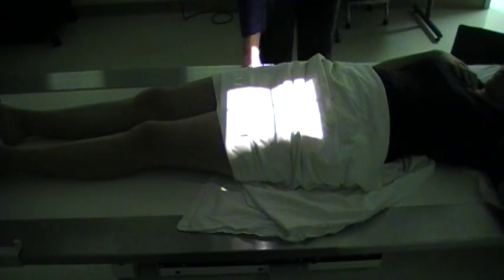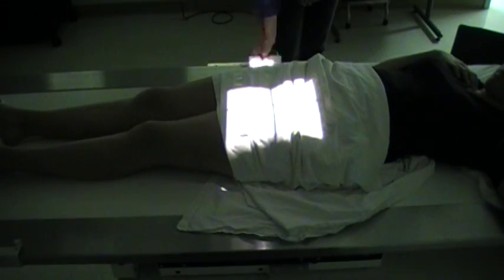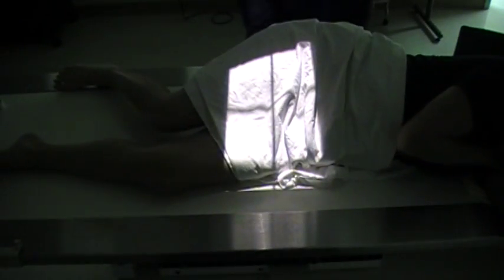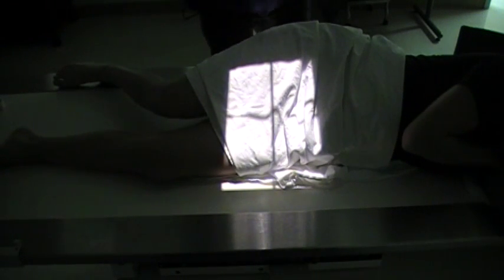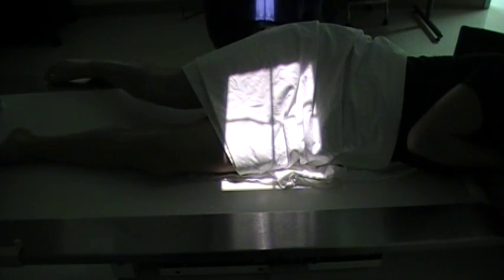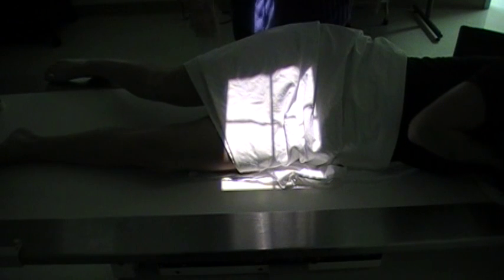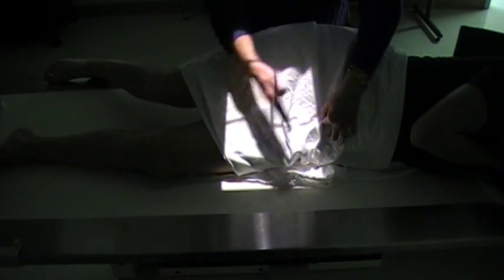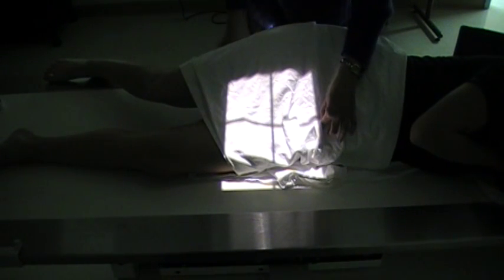Next we're going to do a lateral. So I'm going to have the patient roll up onto the left side. And when we do a lateral femur, we're going to have to do this in 2 parts. First we're going to include the hip joint. Okay, so I've got a 10 by 12 loaded in, and I'm going to palpate the ASIS, have the top of the light field at the ASIS.